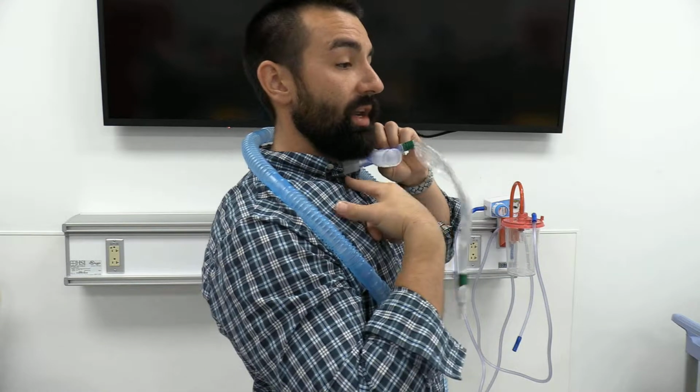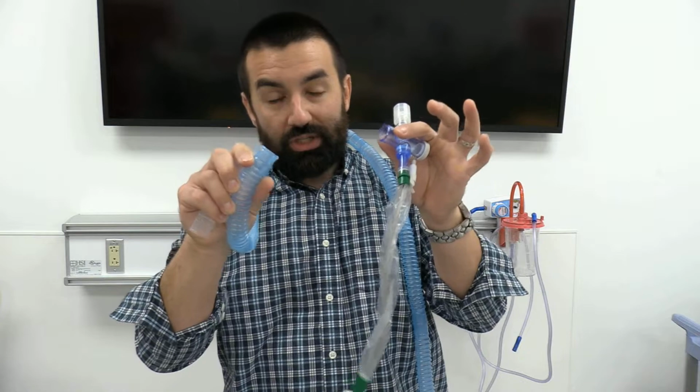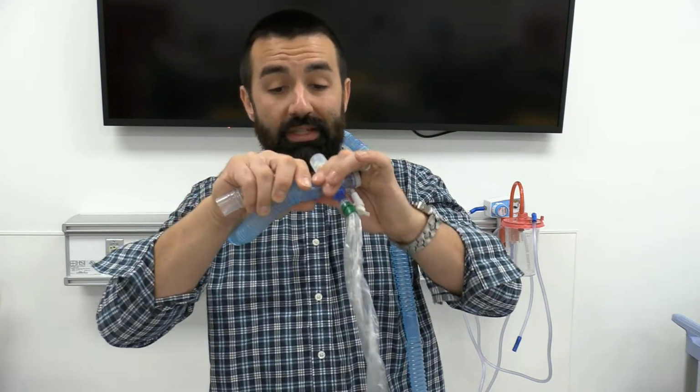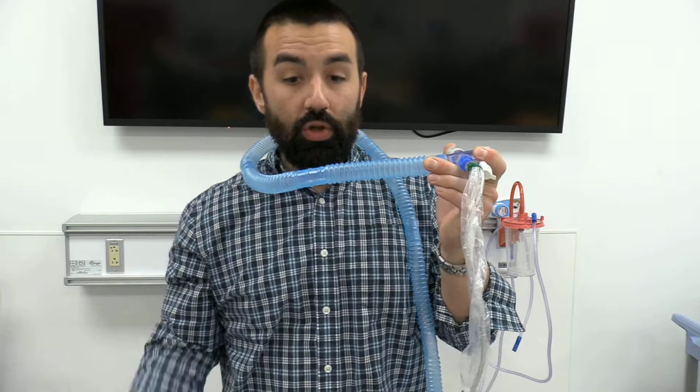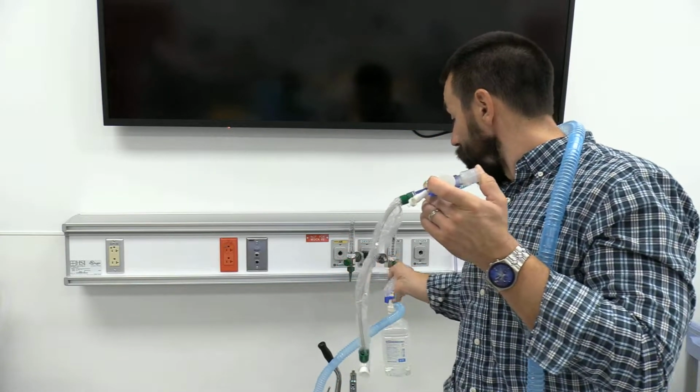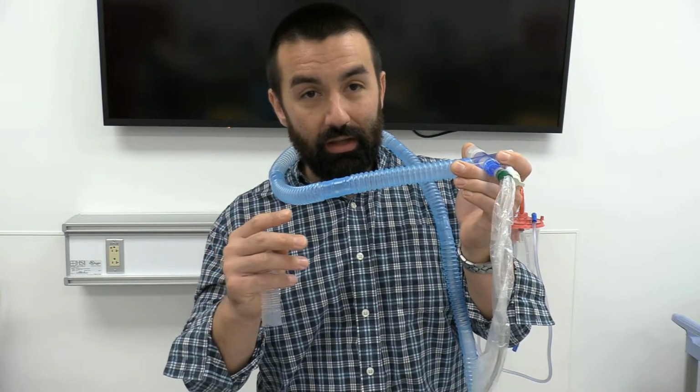A breath would go into the tracheostomy tube, come out, and go back through here and be exhaled out through the machine. Now, if you're doing this with a tracheostomy collar, we actually need an open system. We need a place to exhale. So if you get in a hurry and you put this on a patient, you hook it on a tracheostomy tube, you're going to start building up a whole lot of pressure. You'll hear a very distinct sound here, and sometimes water's shooting out. Your patient would ultimately be rebreathing carbon dioxide, and could possibly suffocate. And it's going to compromise the way that this machine works.